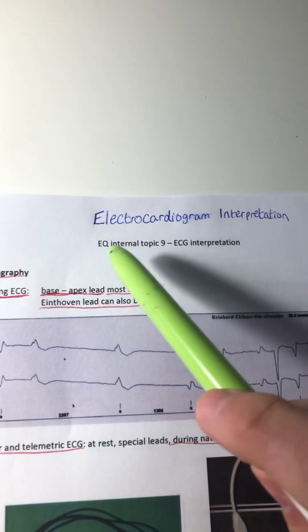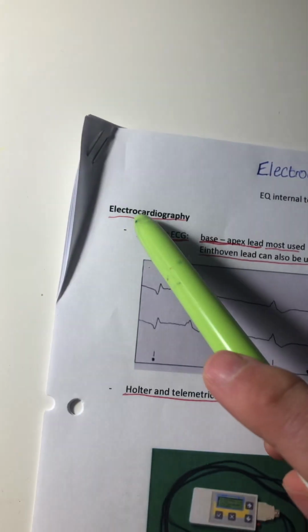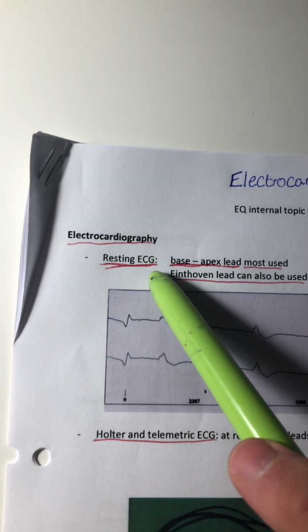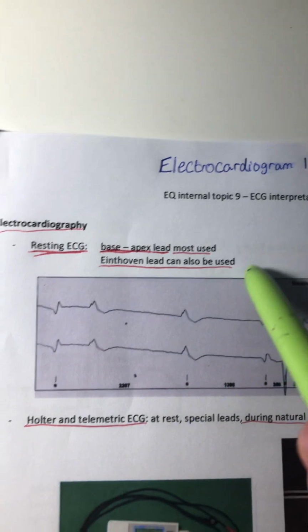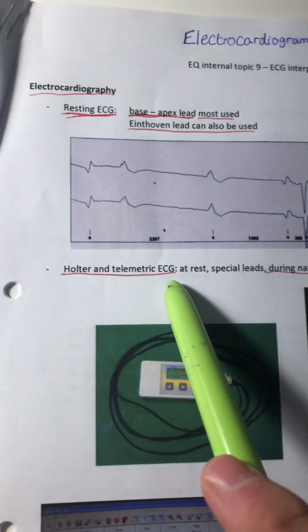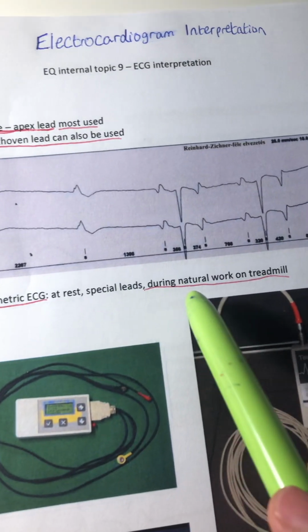ECG interpretation, or electrocardiogram interpretation. Electrocardiography. So the resting ECG, you can have a base to apex lead, this is most used, and you can also have the Einthoven lead. The Holter and telemetric ECG, these are used during natural work on the treadmill.